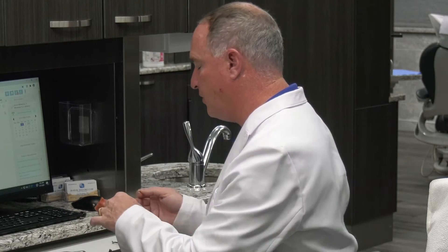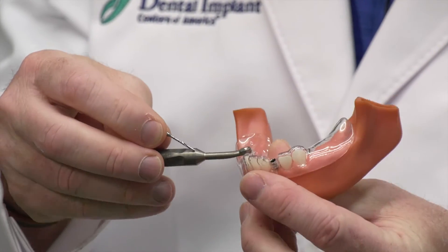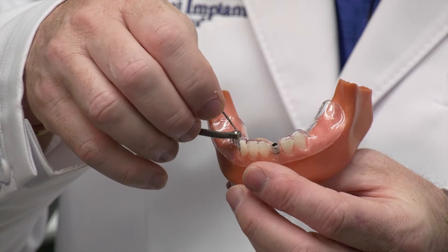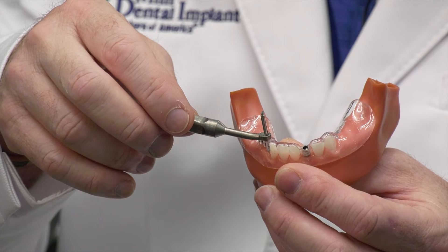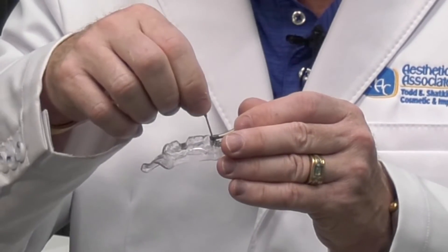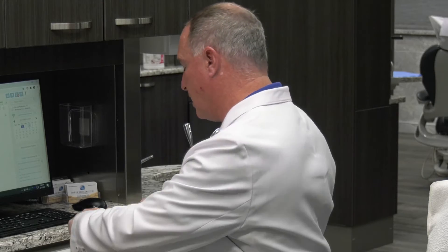The next thing you need to know is if you're using a surgical guide stent — which we highly recommend for your cases — and you use the surgical stent with a pilot drill guide, the pilot drill will be self-limiting. You'll drill your pilot hole all the way down until it touches the drill guide. You don't have to worry about the depth of drilling when you're using a stent because it's already been predetermined to the right measurement. You'll drill all the way down until the drill hits the drill guide, then take it out and screw your implant right through the surgical guide stent.